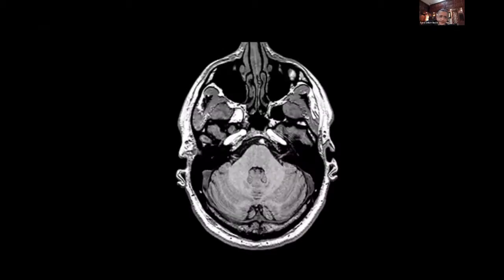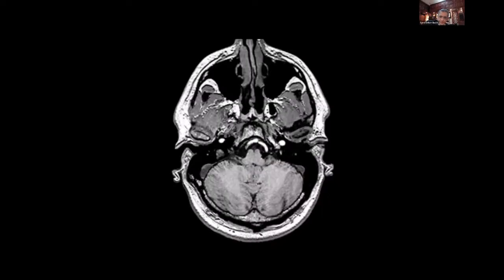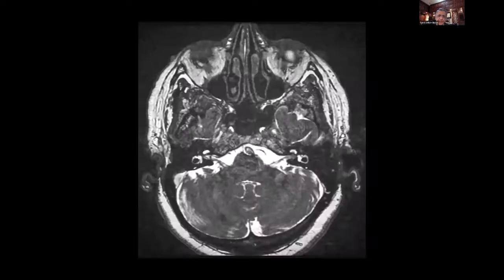Okay, and now this is the pons, this is the middle cerebellar peduncle. Basilar artery, and this is the typical picture with the pyramid of the medulla. So remember that. Don't make this mistake in a hurry. They say, oh, it's a midbrain. This is the shape like this of the medulla. And in certain CISS images, you can see things even better.